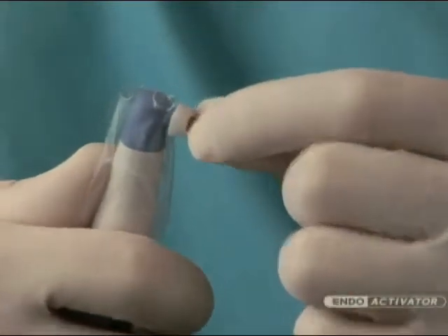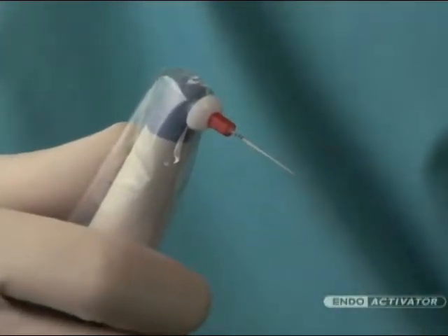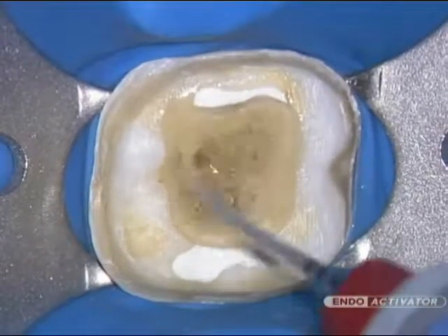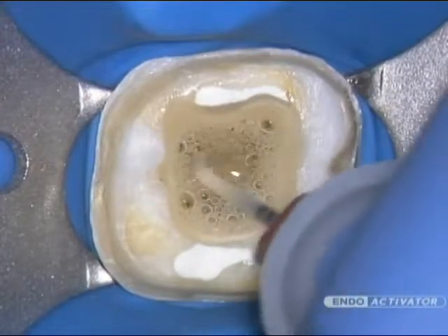The activator should snap on firmly, promoting a secure connection with the handpiece. In fully prepared canals, select the tip that fits loosely and to within 2 millimeters of working length.